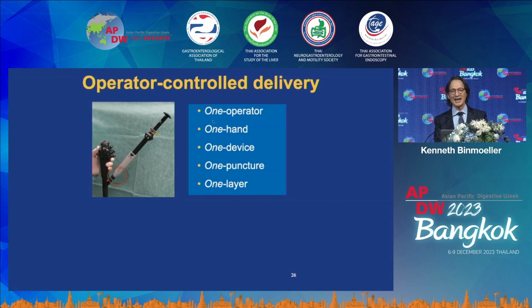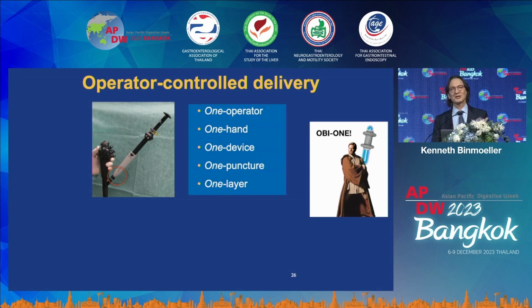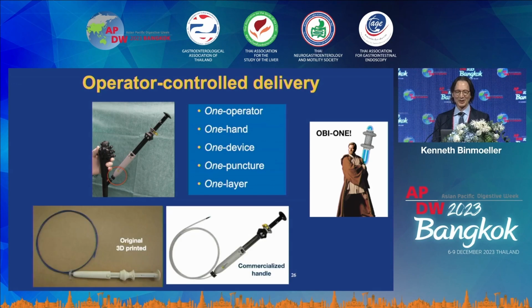So you can see the denominator here is 1, and we even talked about calling this the OB1 delivery system because we were all Star Wars fans. But we ended up just leaving it as electrocautery-enhanced, but I do like the OB1.